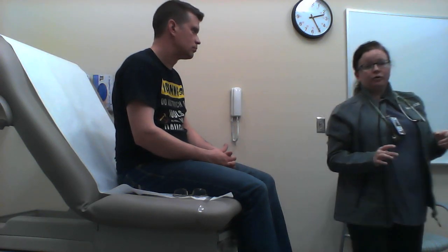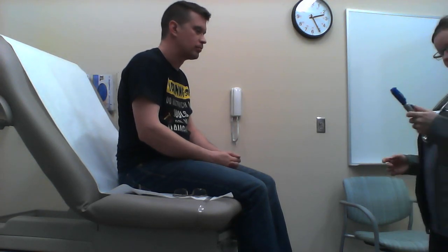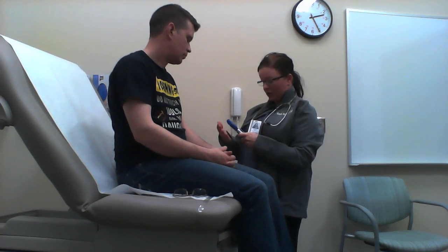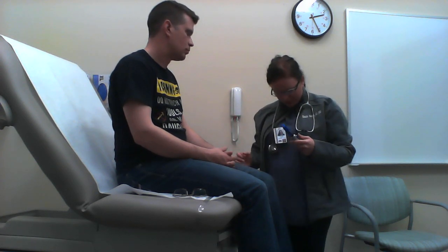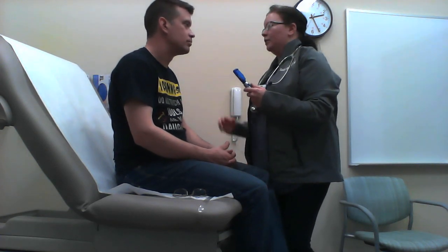I'm going to move on to the ophthalmoscope exam. Turn it on and test it on my hand. Make sure it's set on 0. And again, I'm only going to do this on one side, but we would be doing this on both sides. I'm going to step up here for a second because I'm a little bit short. Okay.